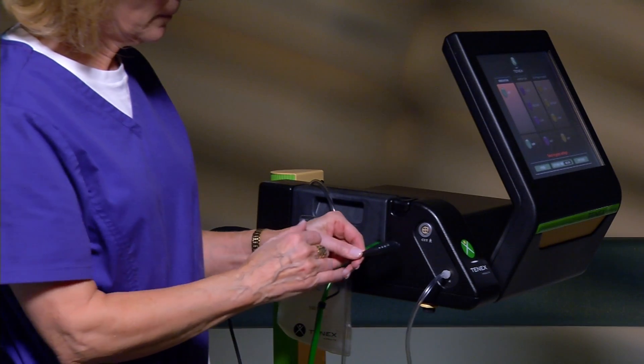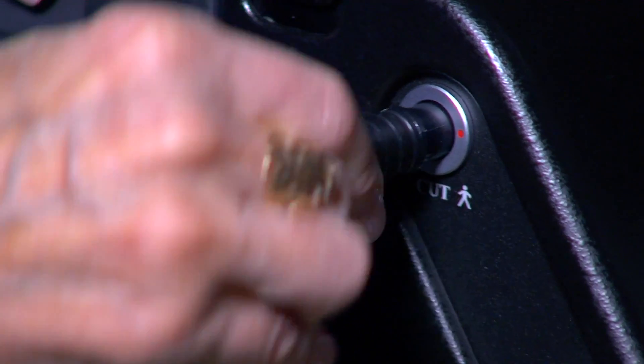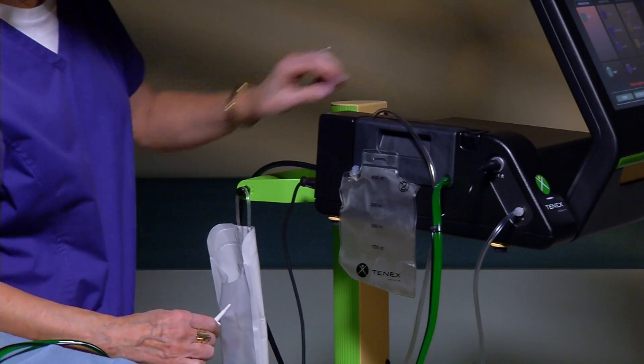Align the recessed arrow or red marker on the TX micro-tip electrical connector with the colored dot on the console side panel cut receptacle. Then insert the connector into the receptacle. Spike the saline bag.